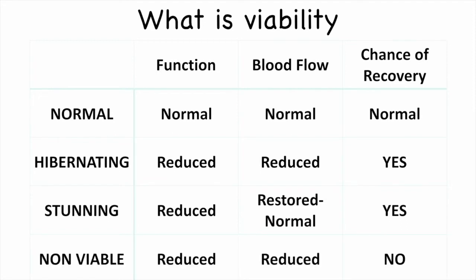Non-viable myocardium, on the other hand, is a segment of the myocardium which has got poor function and poor blood flow and is unlikely to recover even if the blood flow is improved.